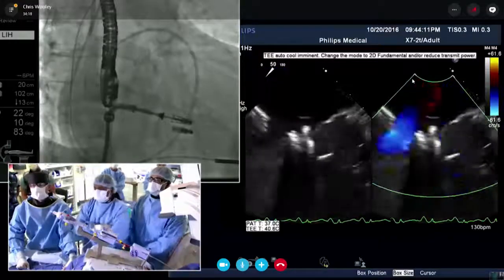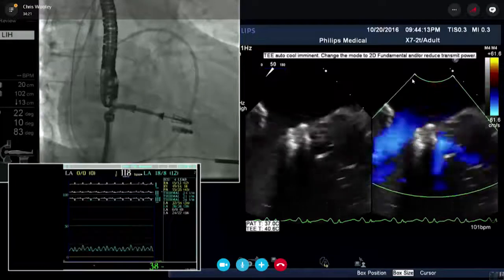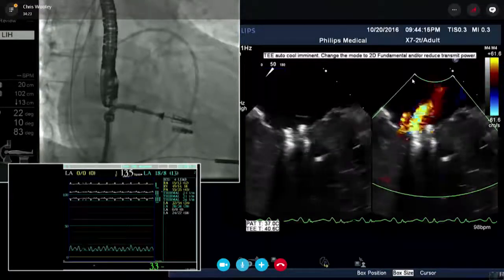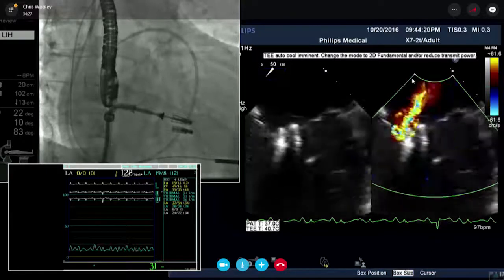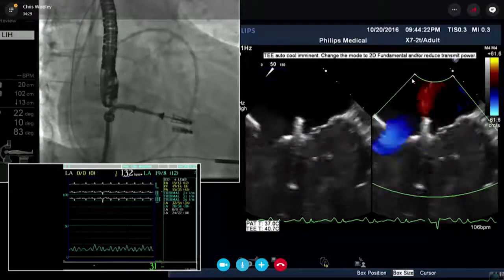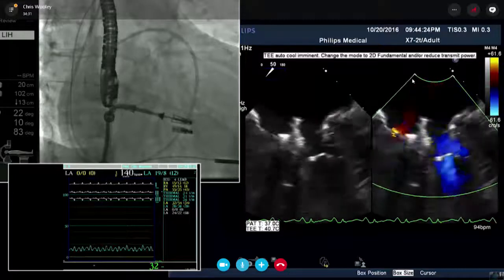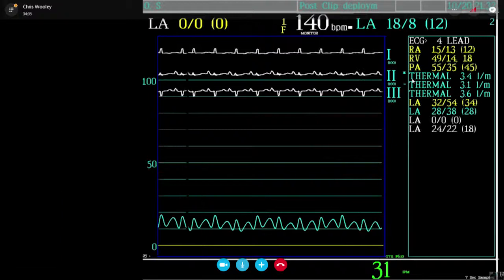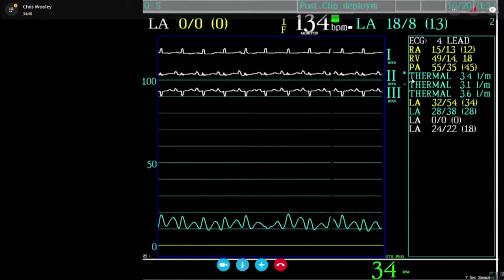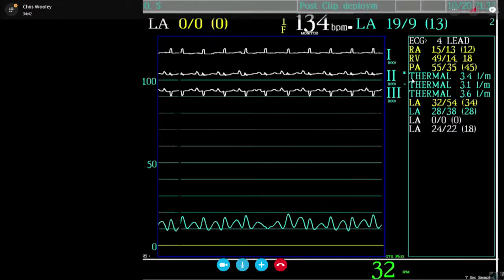And the LA pressure, have you seen the LA pressure now? Can you show LA pressure live, please, Chris? Can you show it large? That's the LA pressure at 12. So remember, we started with 34, and now we're at an LA pressure of 12. And that's the gradient.